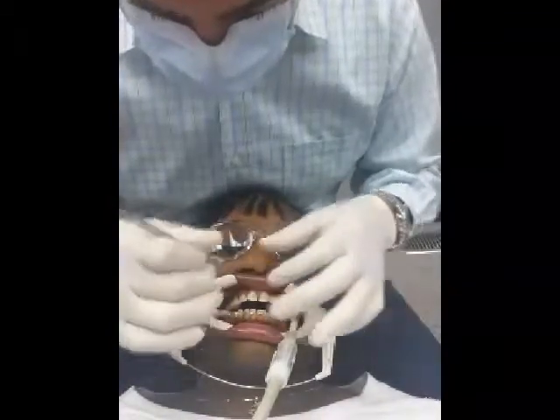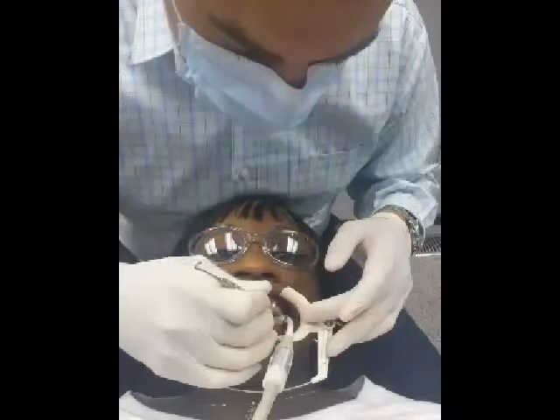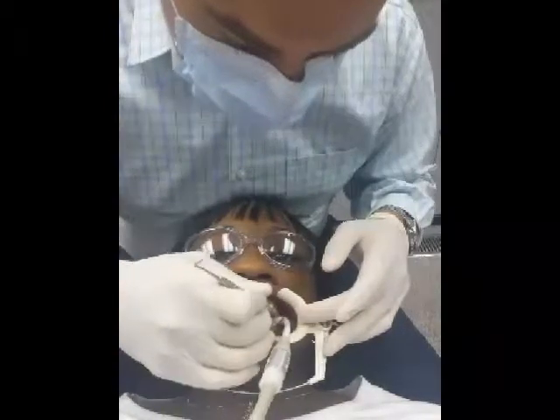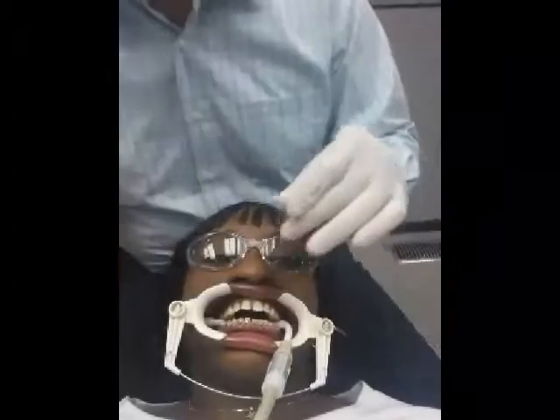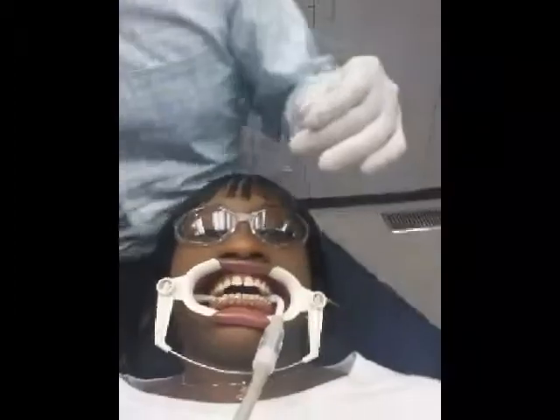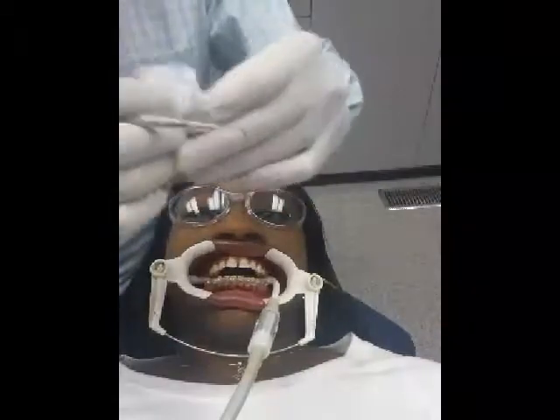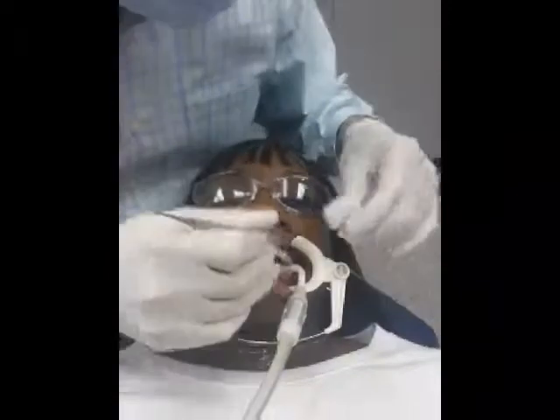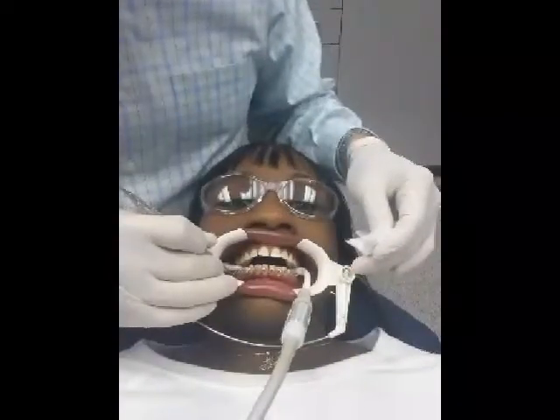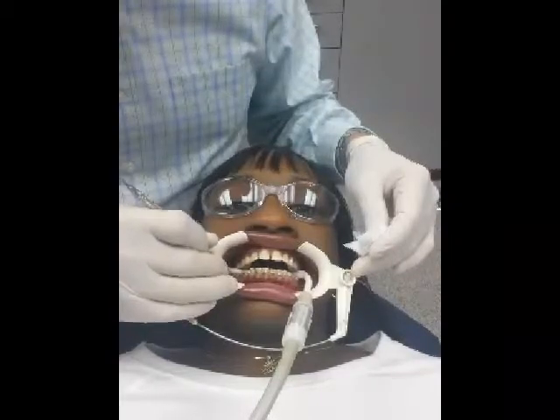So he comes behind and he just pretty much, if the brackets need to be moved a little bit on my tooth, he moves them and puts them in the right position that he wants them to be in. And then he kind of just scrapes away the excess glue before she dries them, because if he leaves it on there, it'll just be hardened glue in different places around my tooth. So he just scrapes away the excess glue and checks the brackets.